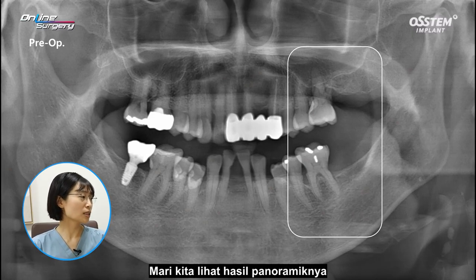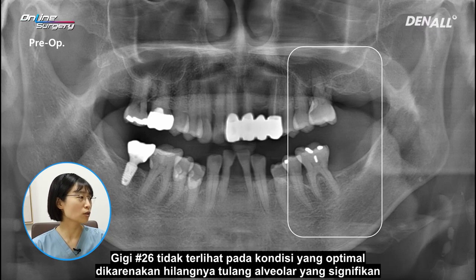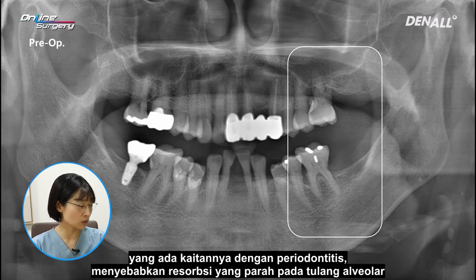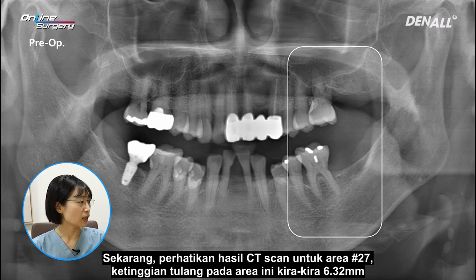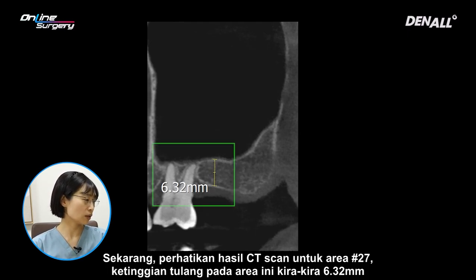Let's take a look at the panoramic radiograph. As you can see, both teeth number 27 and 37 are scheduled for implant placement. Tooth number 26 does not appear in optimal condition with significant alveolar bone loss attributed to periodontitis, resulting in severe resorption of the alveolar bone. Now, examining the CT scan for site number 27, the bone height at this location measures approximately 6.3 millimeters.